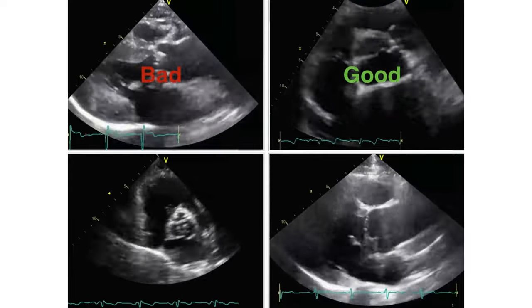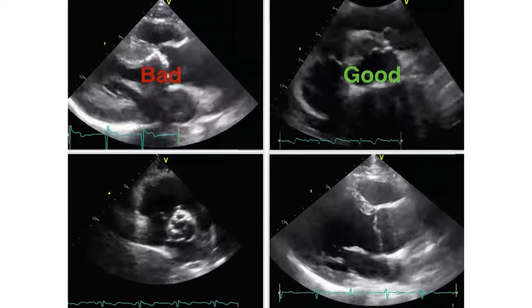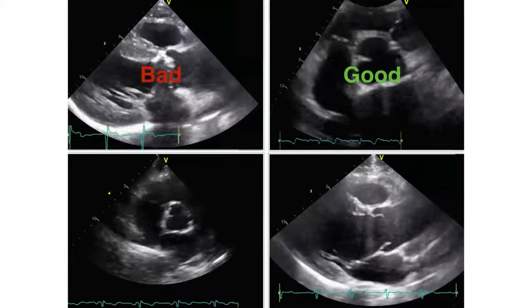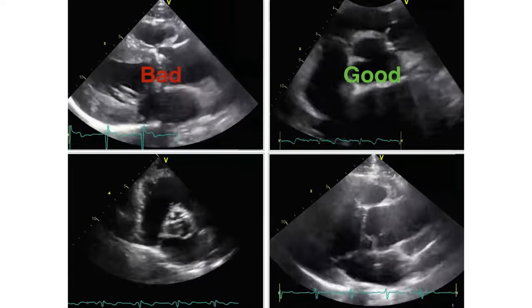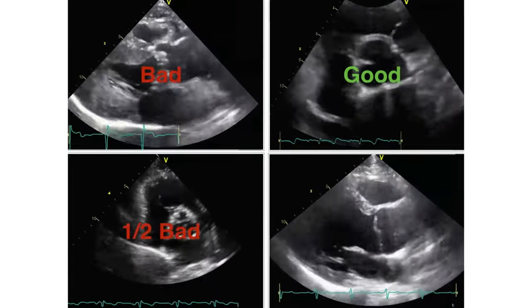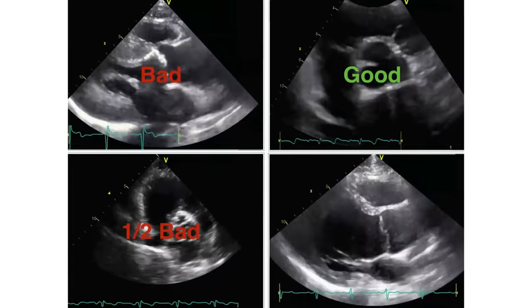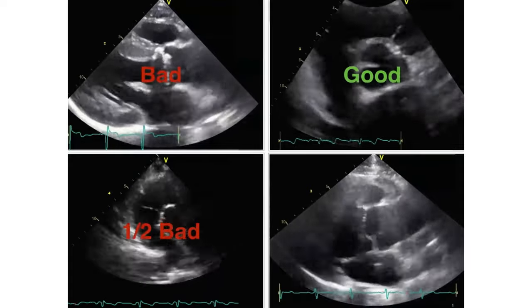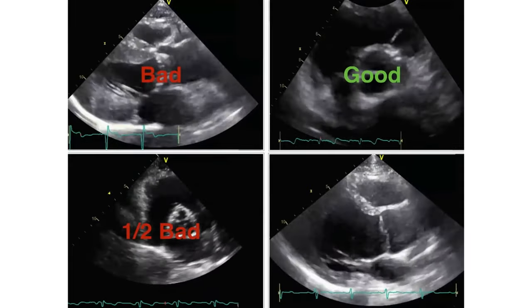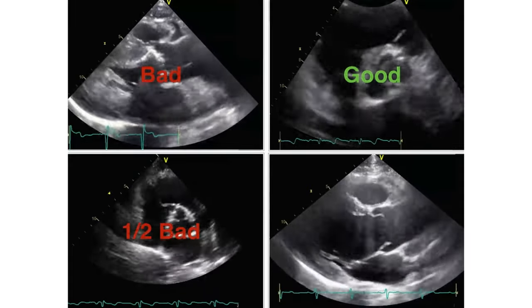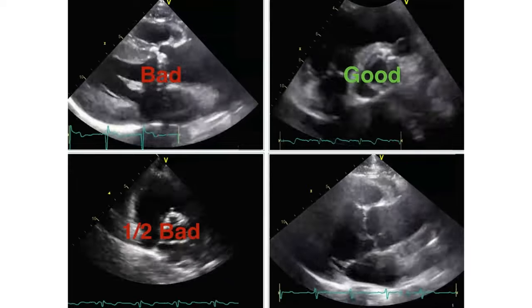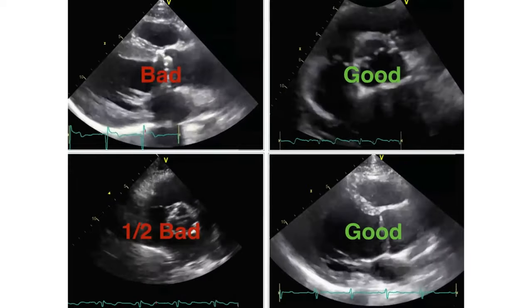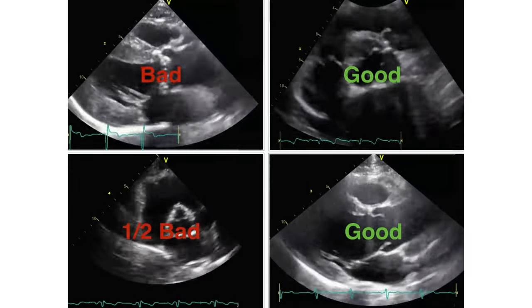The third one — I would say this is half bad because it's calcified; it's a rigid valve but still opens. And the last one is a normal valve, we can say it's good.